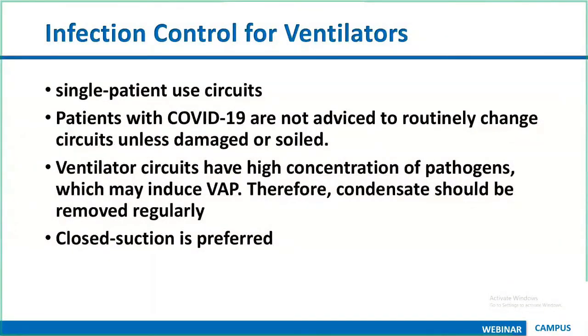You don't have to routinely change the circuit. Ventilator circuits usually have a high concentration of pathogens, which may induce VAP. Therefore, these condensates, these secretions, should be removed regularly. Whenever you are disconnecting the circuit, this is another point you should be very, very clear about. With a COVID patient, whenever you are disconnecting, either to change the filter, or to put on or remove the closed suction, or to put an expiratory filter, you have to always put the ventilator on standby.